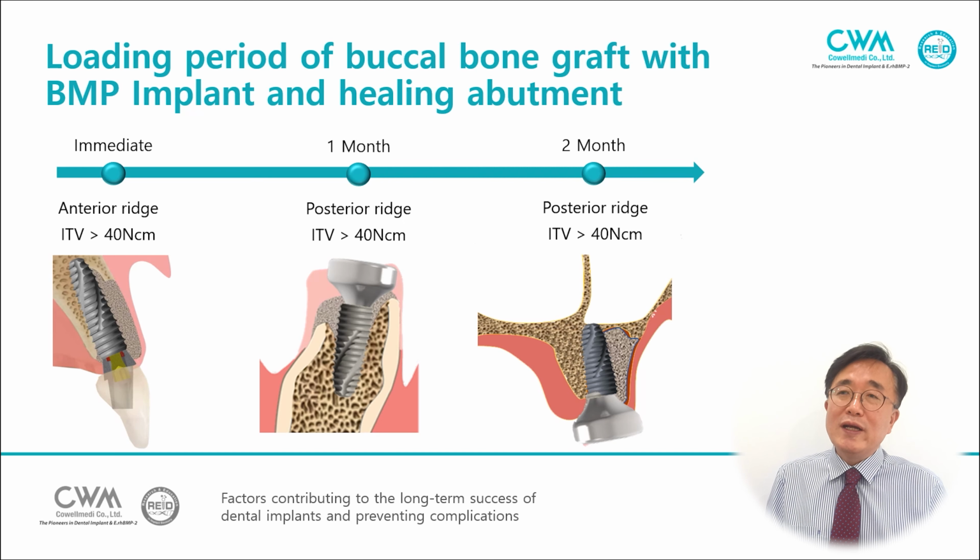We can connect a wide healing abutment, and after 1 month we can insert the restoration. And in the posterior of the maxilla, the implant was fixed with 40 Newton centimeter torque. Here we can connect a wide healing abutment. This posterior restoration is connected after 2 months.